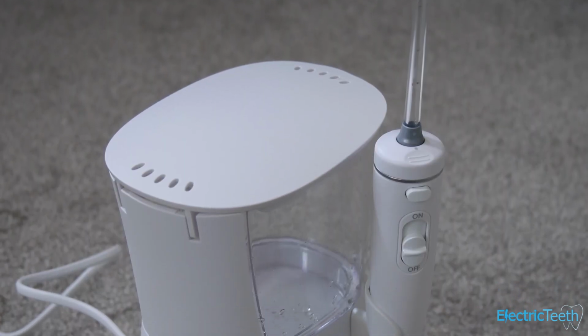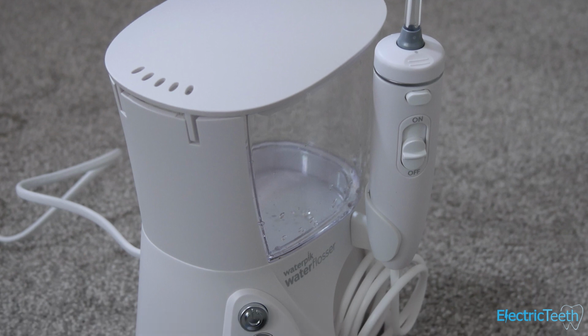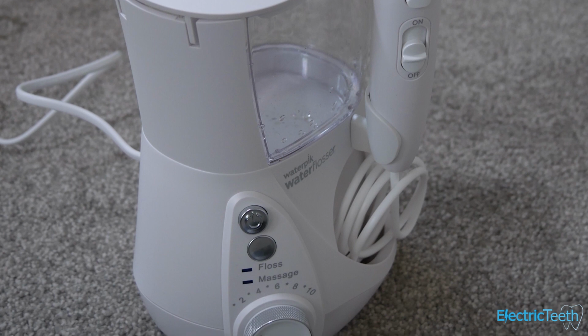So the model I've been testing is the Waterpik WF05, that's the professional whitening model. There's also a WF06, which is the same whitening model, but it doesn't have the professional features. What that means is it loses the built-in timer and massage mode, and there's a slightly different design to the two units, but essentially they're very similar.